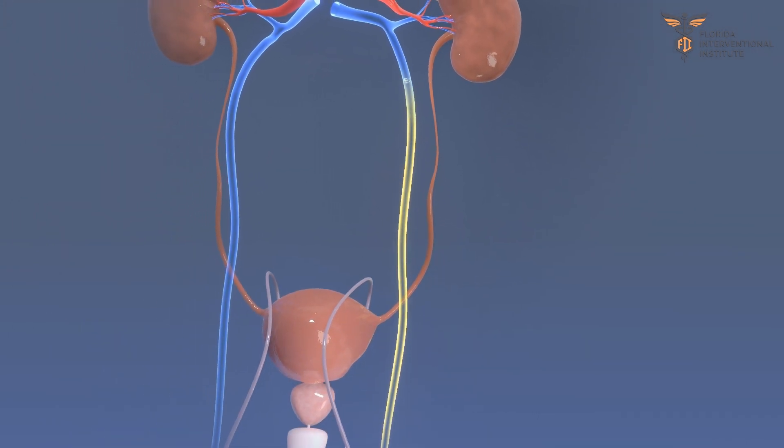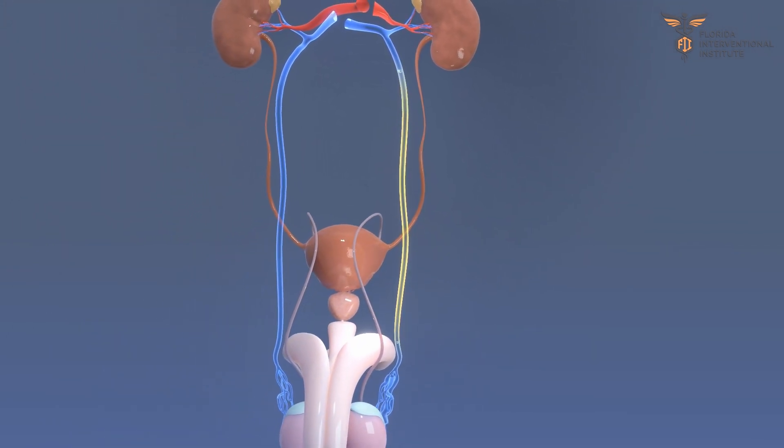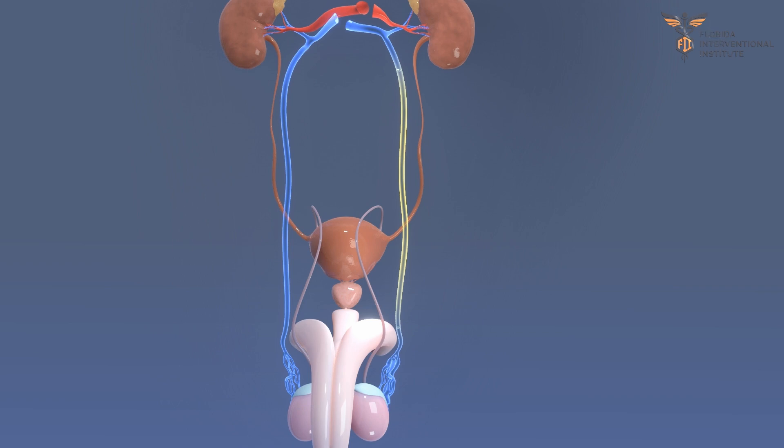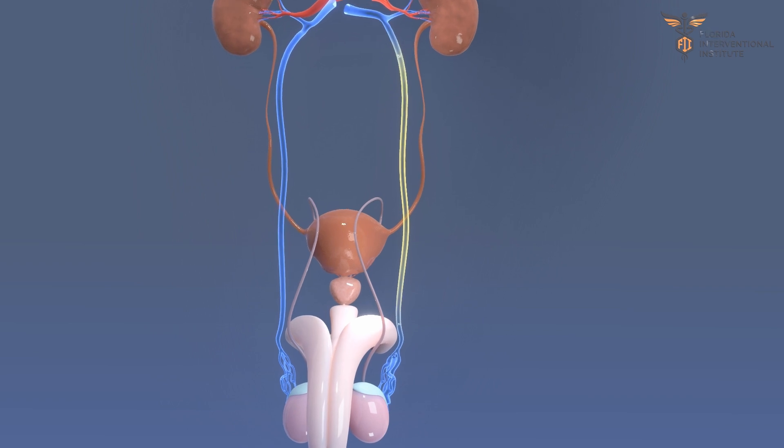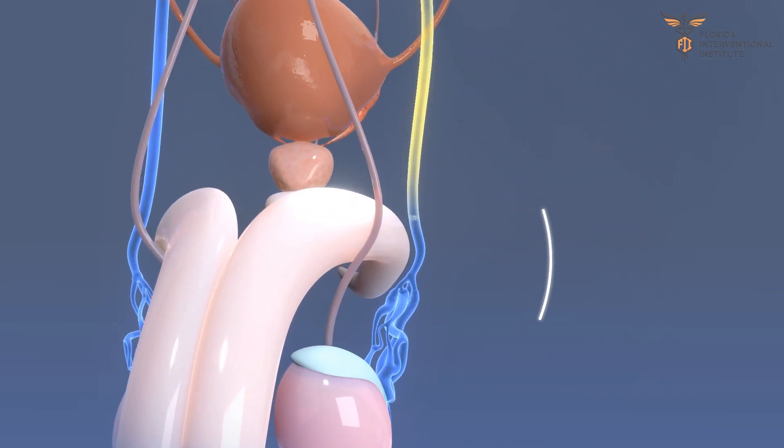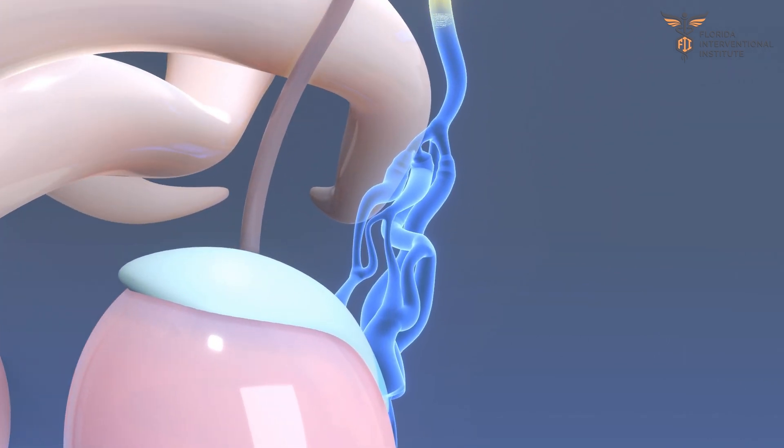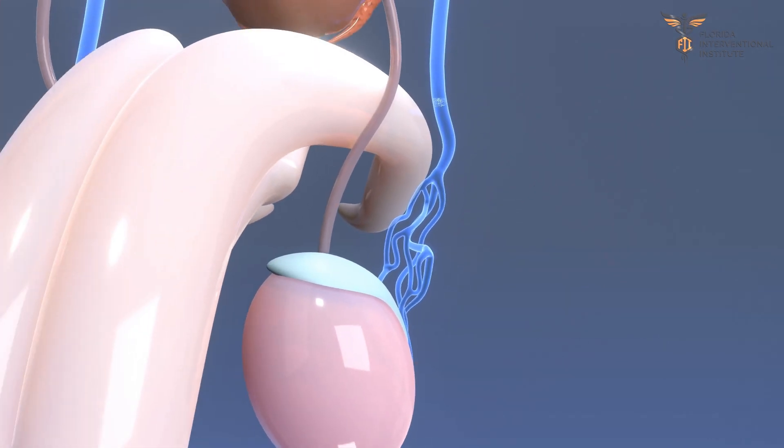This technique effectively blocks a segment of the gonadal vein and prevents any reversed flow of blood towards the testicle. With no blood flowing under pressure towards the testicles, the varicocele shrinks and gets back to their normal size.